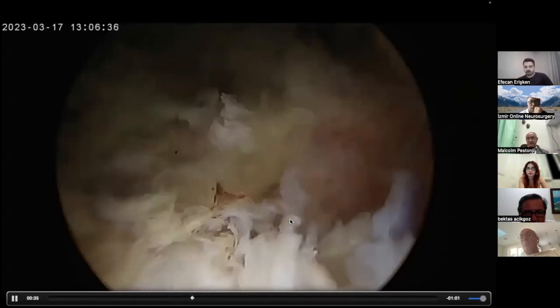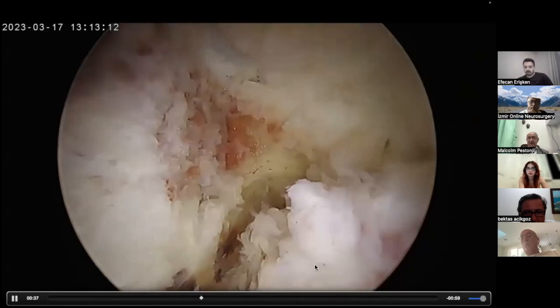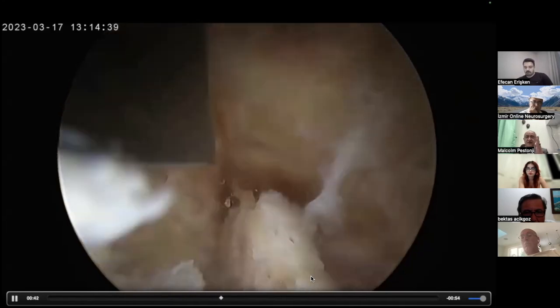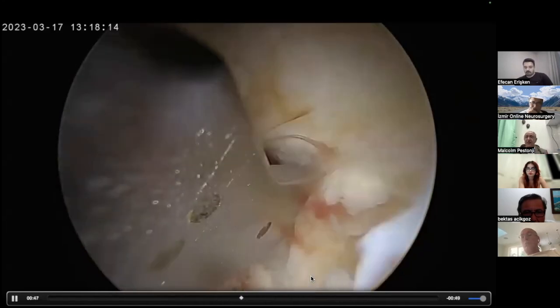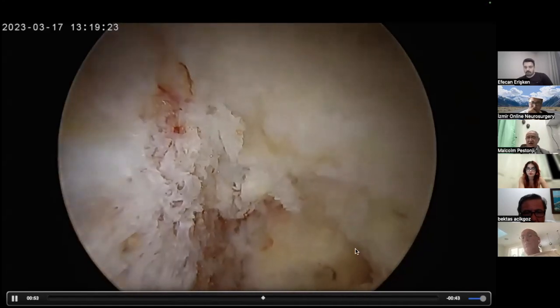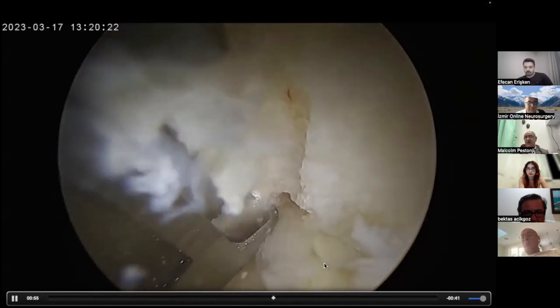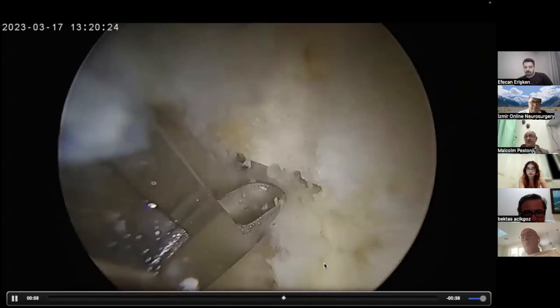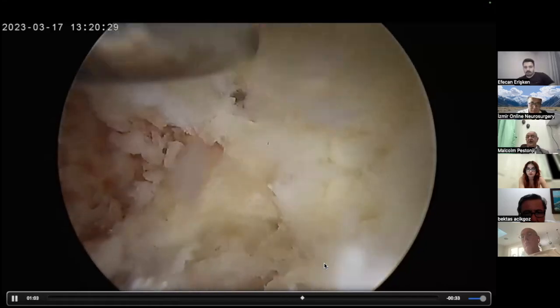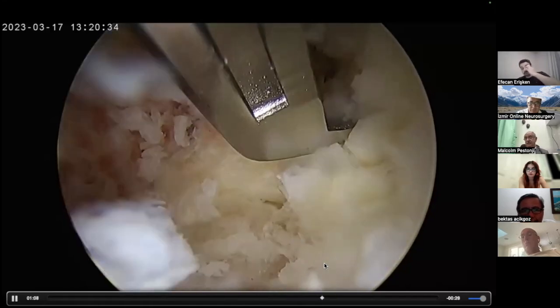Now I start opening up the flavum, the root canal, and I can see the tags on the root. The root is free. Now I do salami slicing, slowly keeping on cutting and breaking away pieces of bone that are deep inside the canal. The superior articular process has invaginated so deep that even after so much removal, I'm not able to see its tip. So I have to cut more of the IAP corner. I have to go up. Unless I go up, I won't be able to remove it. If I can't remove it, I have not decompressed the root. The old lady is not going to be comfortable with her pain.